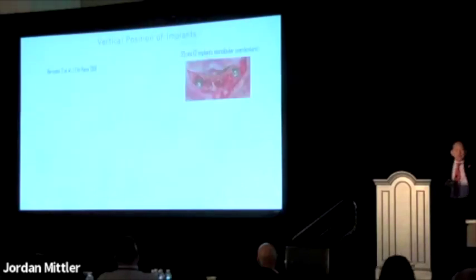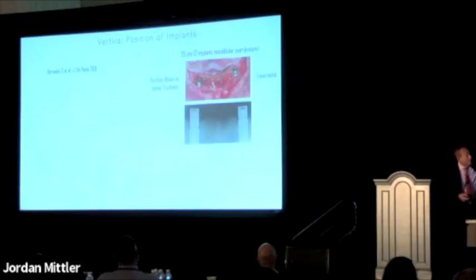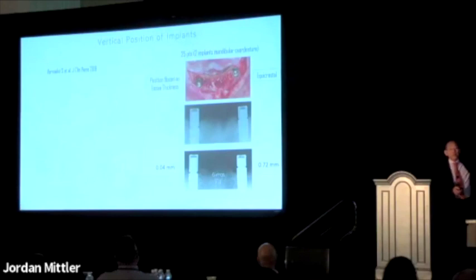So I told you that other studies did not find what Tom Linkevicius found. This study was a split mouth study, patients that had 2 implants for locators. So it's the same prosthesis, same patient, they place 2 implants. But one would be placed at the crest, and the other one 2 millimeters below the crest, but with a tight conical connection. And what did they find? The one that they placed deep inside the bone had no bone loss because the connection was a lot tighter. The one where they placed it at the crest had 10 times the amount of bone loss than the one that was placed inside the bone.